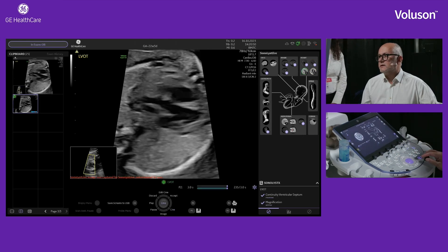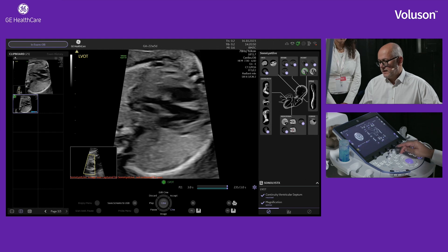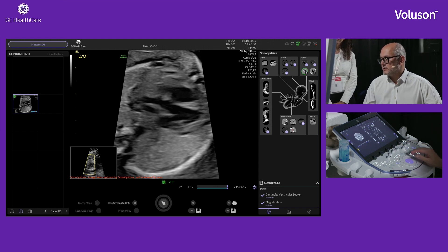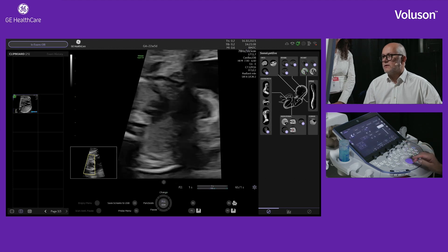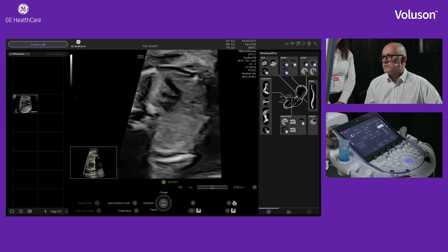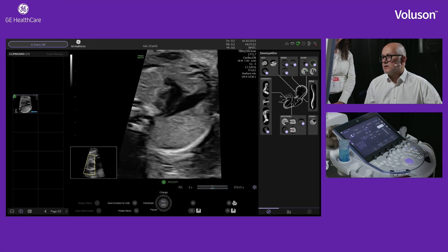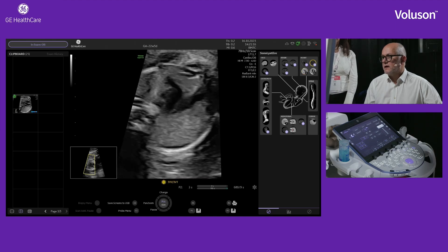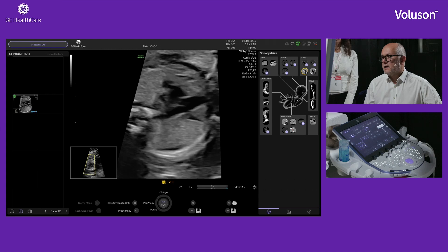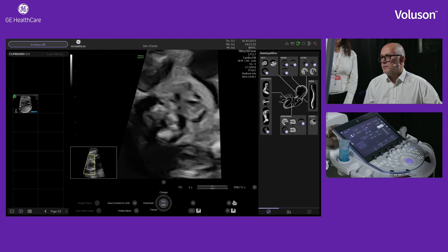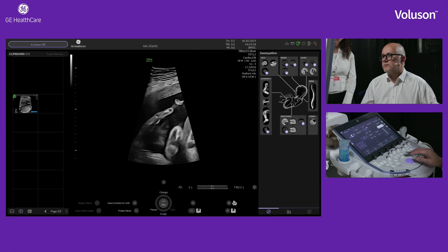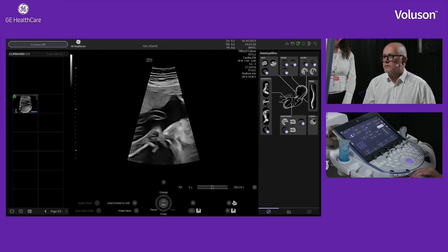Each single view has imaging criteria, and some images have more criteria than others. For example, the abdominal circumference has lots of imaging criteria, while other views such as the three-vessel view have fewer criteria. All of those are available to view as you go through the fetal ultrasound scan, if you wish.